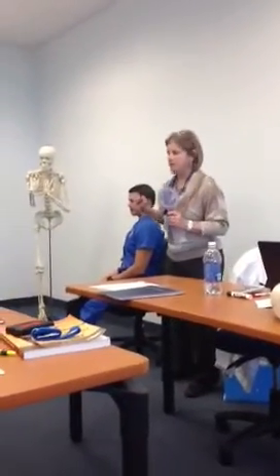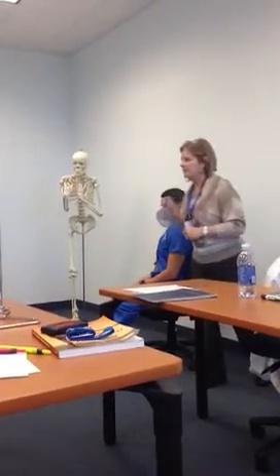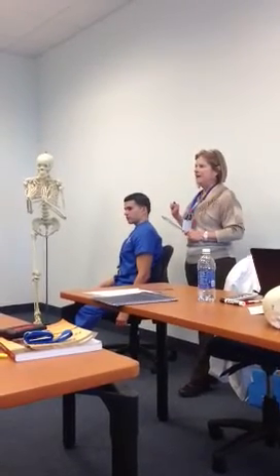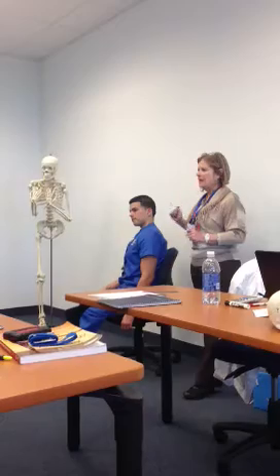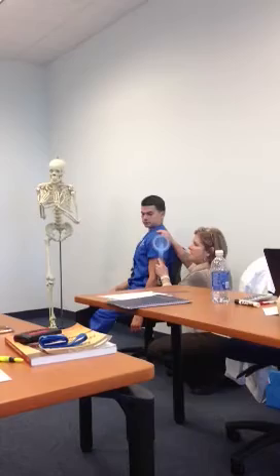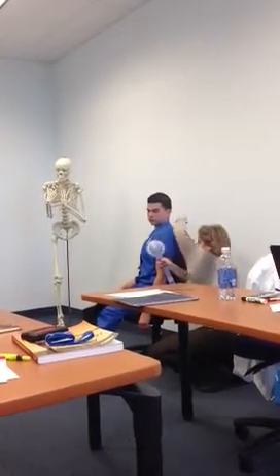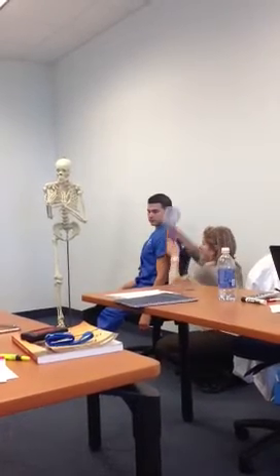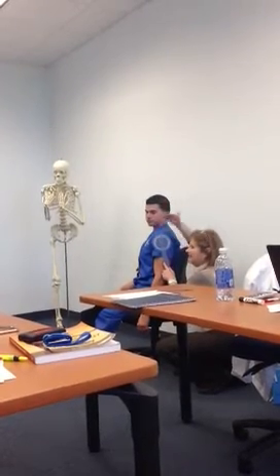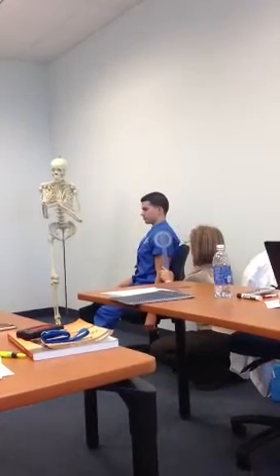by measuring shoulder flexion. Remember when we were talking about axes and planes? Flexion is in what? Sagittal plane, frontal axis. Why? Look at this. You use your goniometer. This is where I'm going to put my goniometer. So, where's my axis? Frontal. Frontal. Frontal. Where's my plane? Sagittal. Okay? So, this is going to be my 0 here.